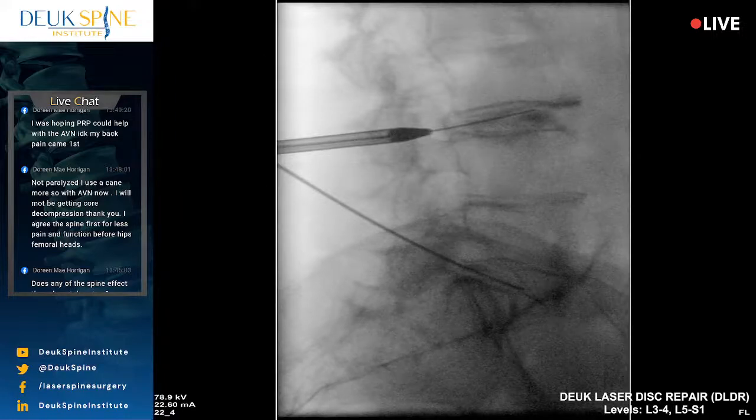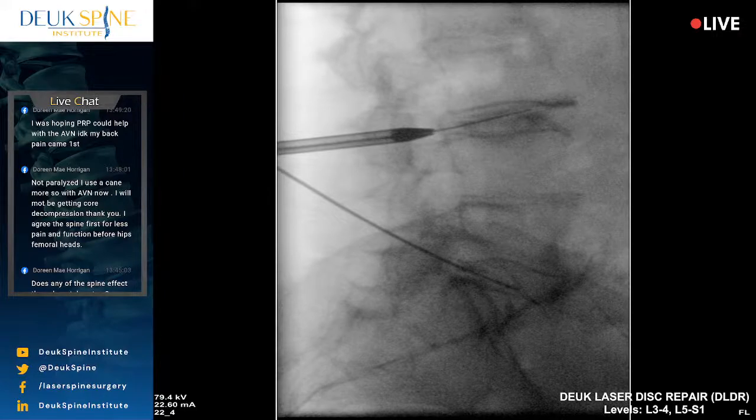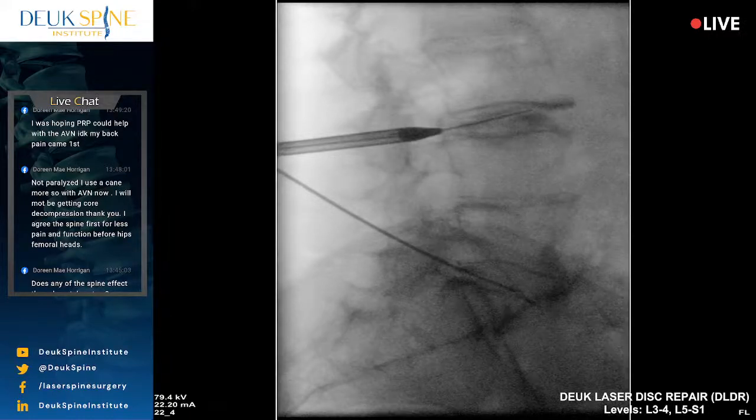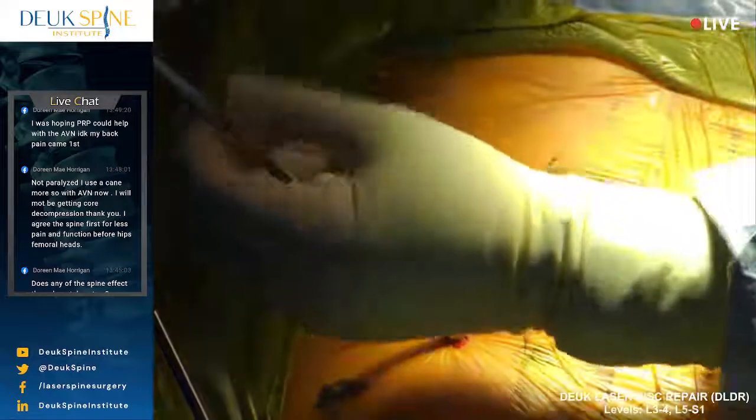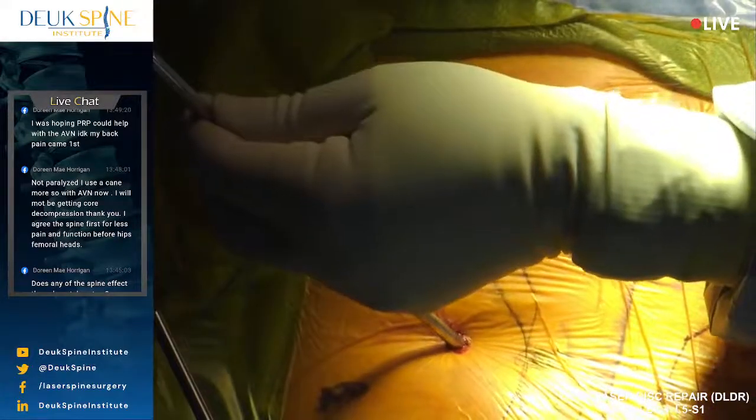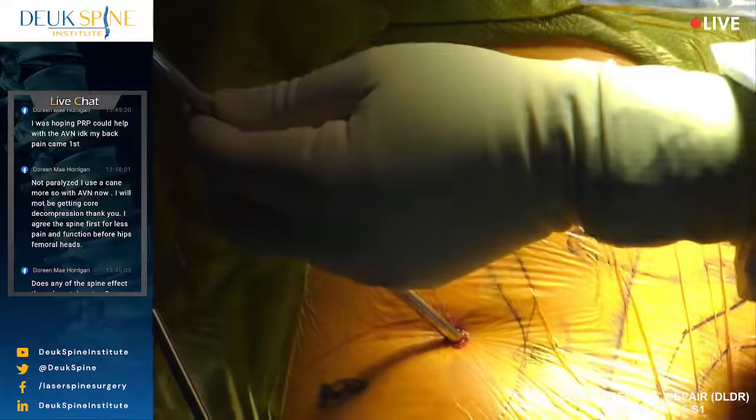In the foramen, up against the herniation. You guys can see the herniation, right? Sticking out backwards. That's what's left on my side, the right side. Right here, I can feel it. So I need to advance this dilator along the guide wire into the L3-4. Any other questions?